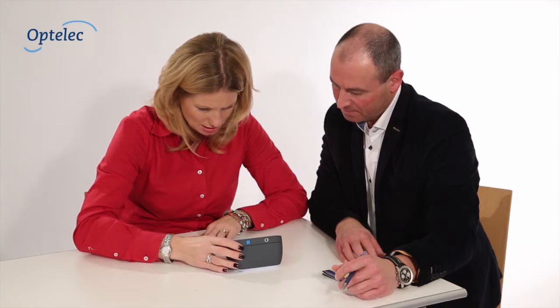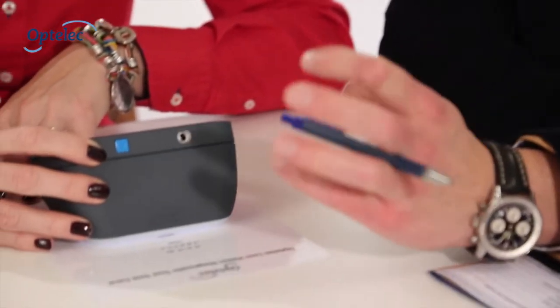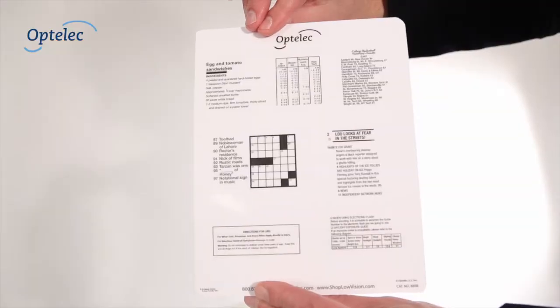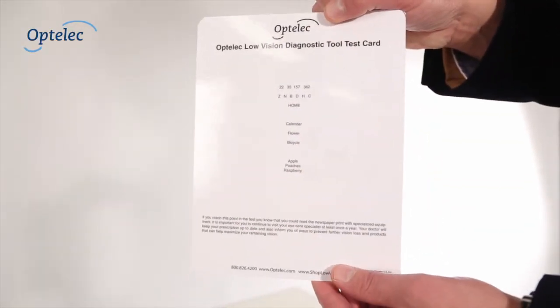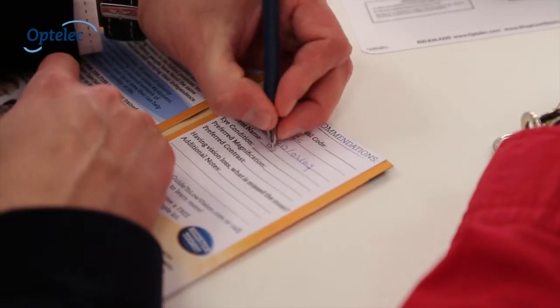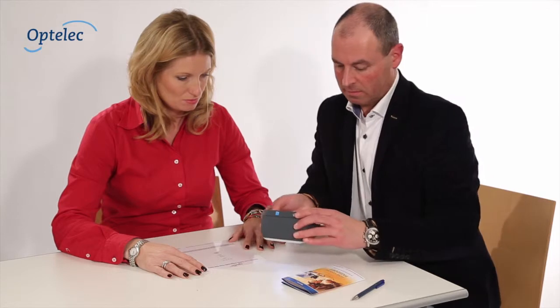It is professional, quick, and proven. It has been designed with an all-inclusive kit which contains the following: one electronic diagnostic tool for the evaluation, an instruction manual with a quick start guide, a two-sided reading test card with real-life examples, and low vision passports to provide to your patients about available vision aids that can help maximize remaining vision and maintain their independence.